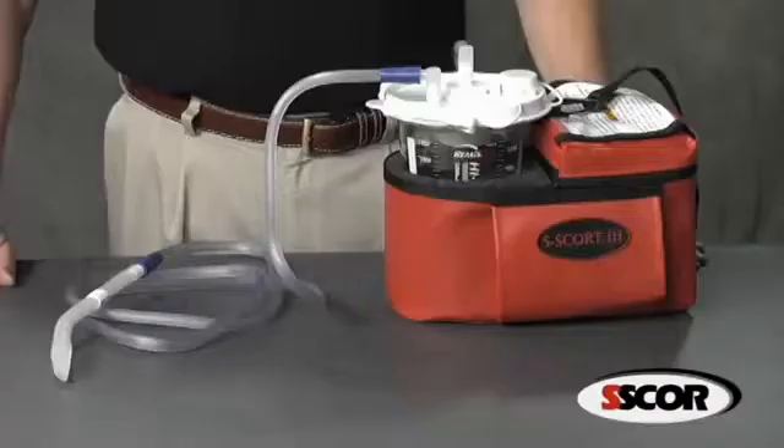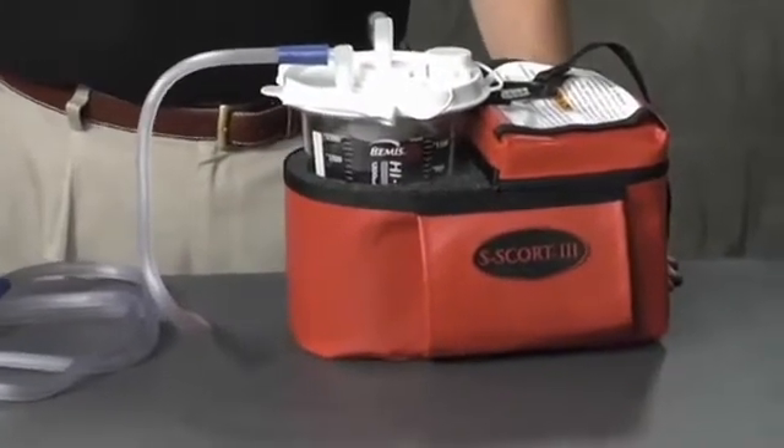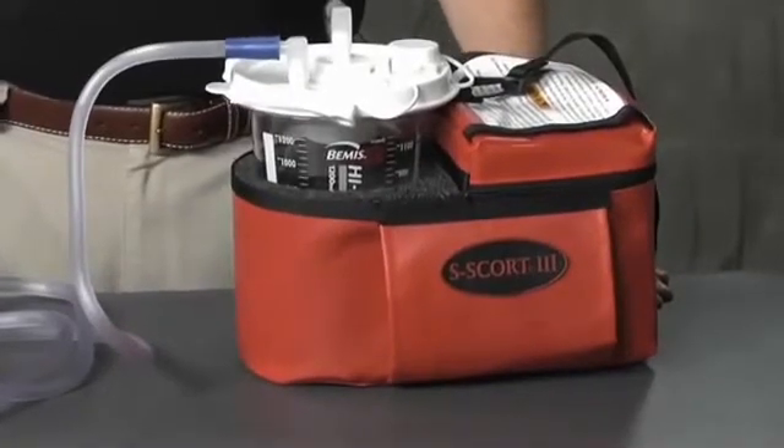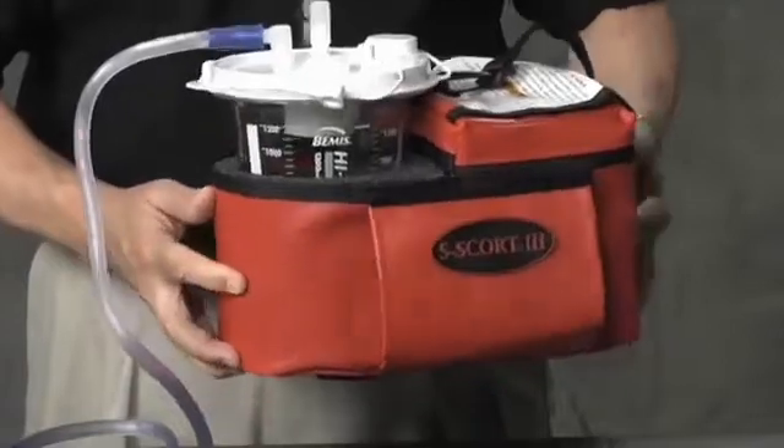Hello and thank you for considering the SCORE Escort 3, number 74,000. The Escort 3 has been the go-to suction unit for hundreds of EMS agencies for years. Its simplicity and ruggedness make it uniquely suited for field suctioning.